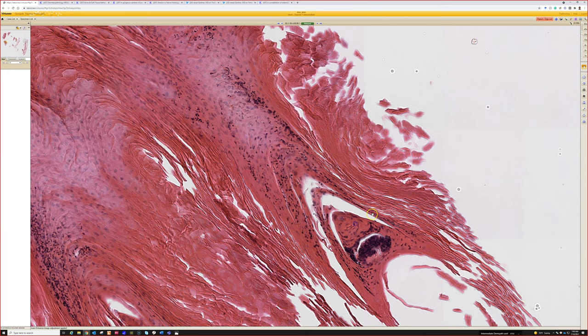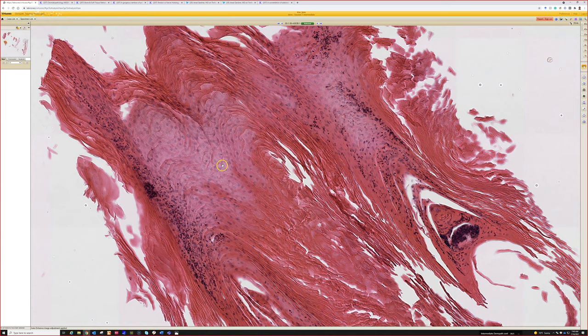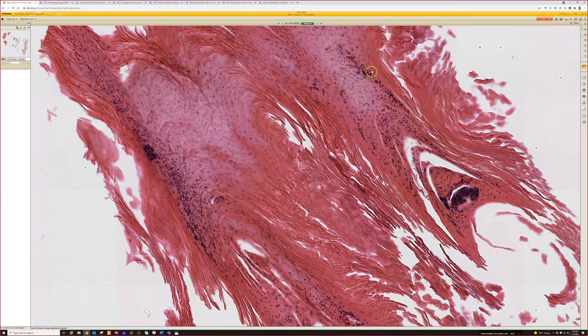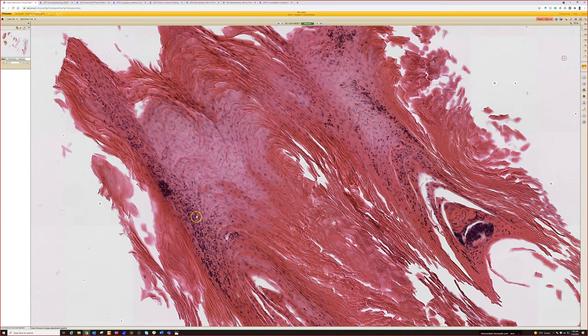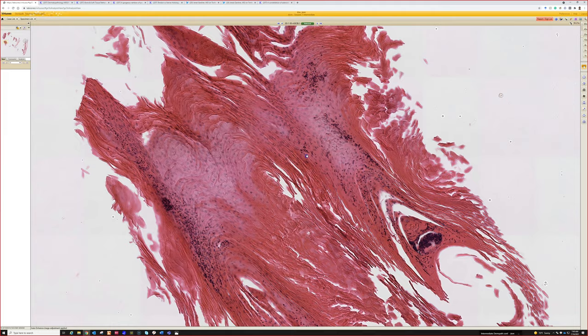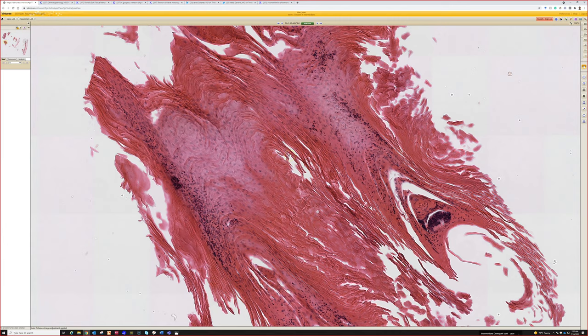Let's say the patient had multiple nail involvement on the hands and the feet. What might you think of? Nail psoriasis. When I see a lot of neutrophils and parakeratosis in a disorganized nail plate and fungus has been ruled out — because fungus can produce similar features sometimes — it's worth at least raising that in the right clinical setting this could potentially fit with nail psoriasis. Nail psoriasis can be hard to recognize, particularly for physicians who don't deal with it very often. Sometimes patients get treated like they have fungus, and it takes a while to figure out this is actually an unusual manifestation of psoriasis.